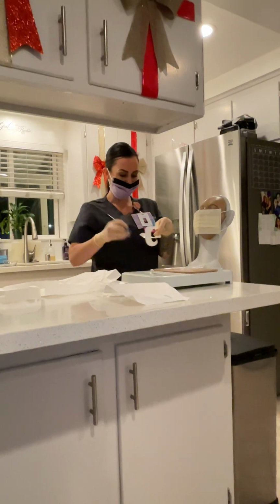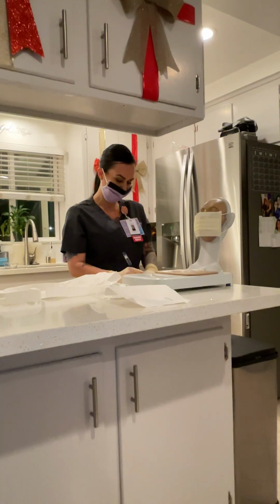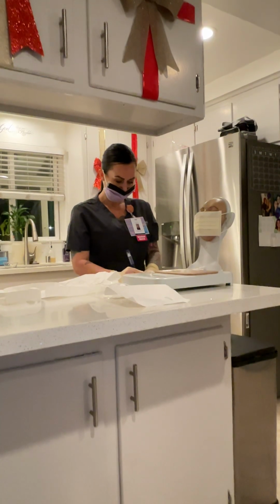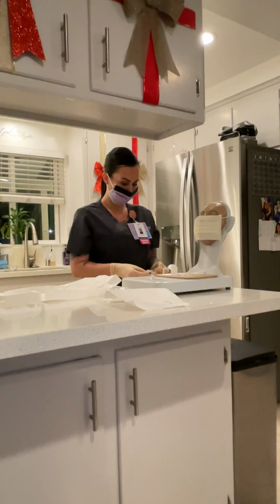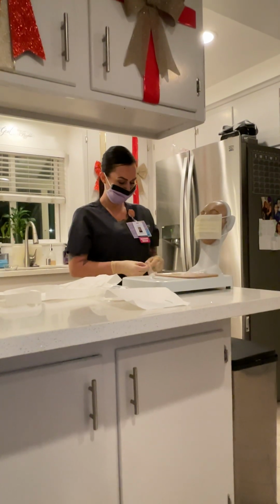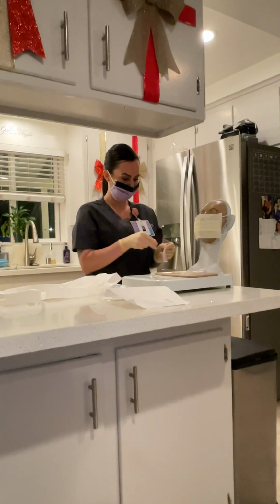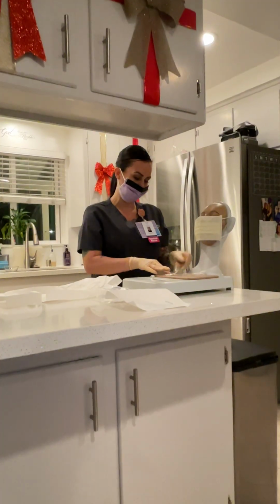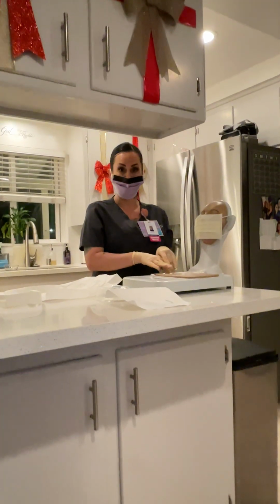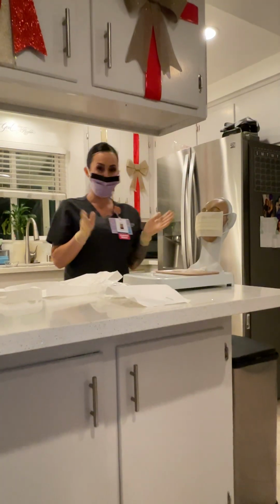And we're going to want to get our pen and we're going to put today's date and our initials. We're going to place it right on the outside so that the next person who's going to see their dressing will see when it has been done.